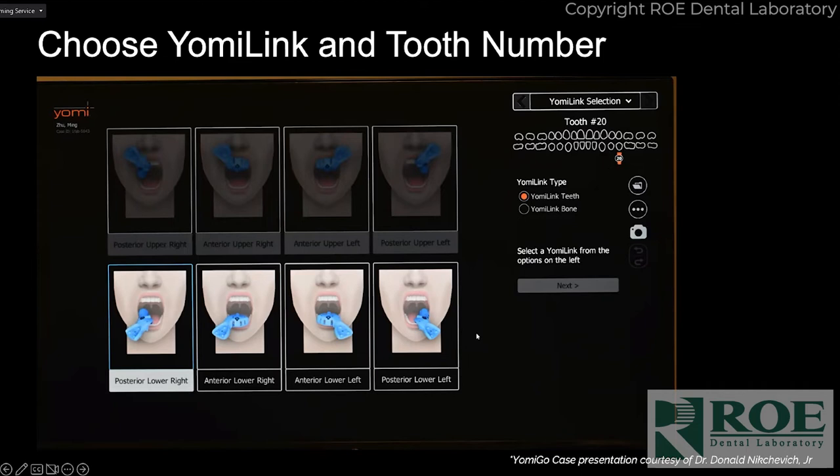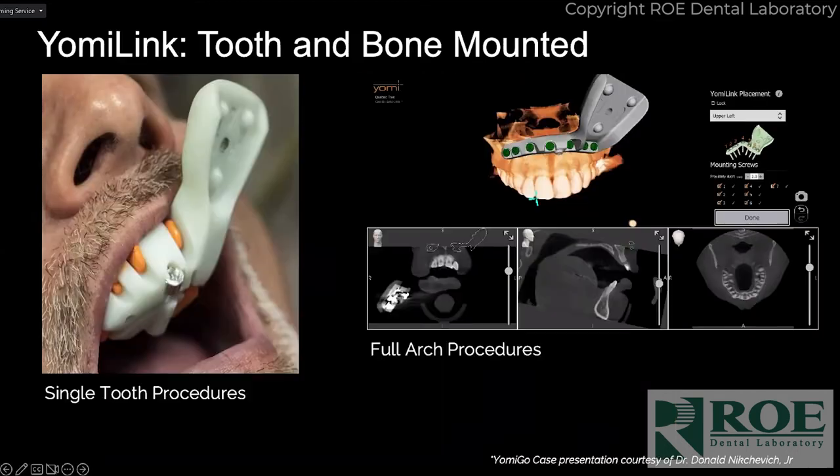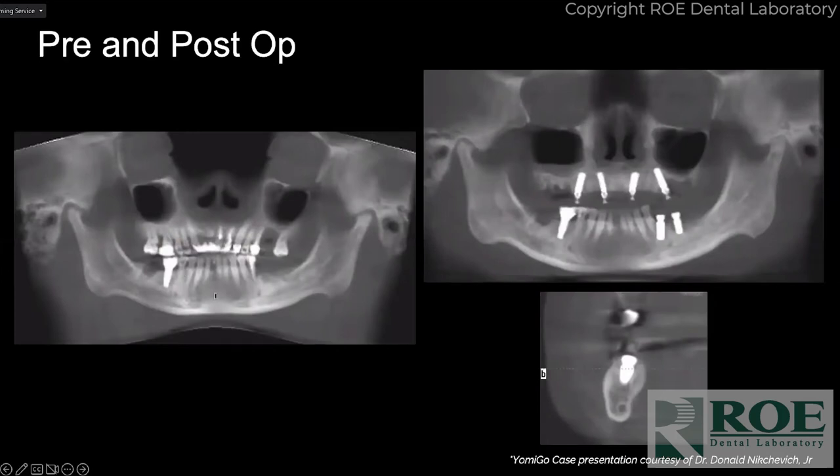With the new software you can tell the computer where you're going to place your Yomi link and also the tooth number of where you'll be working. This is the Yomi 2.0 software. This is the Yomi link tooth in position, and this is the new Yomi link bone — you can see it has a more acute angle and seven options for your screws. The reason I like this pre-planning is you can pre-plan where you'll place the splint and know if any planned implants will conflict with these screws.